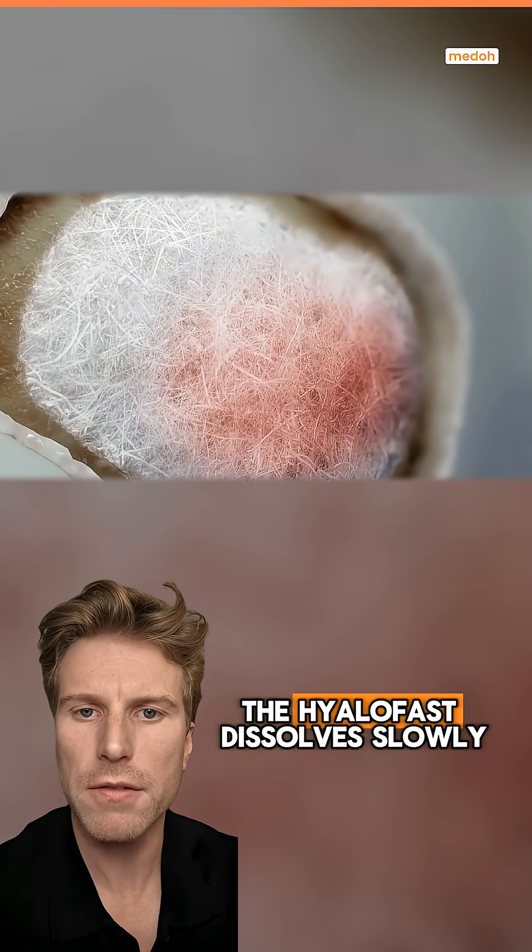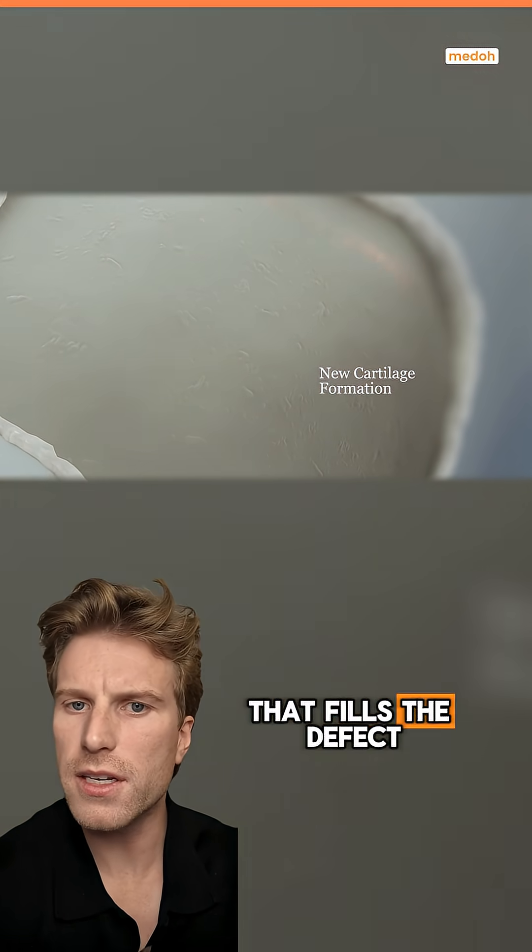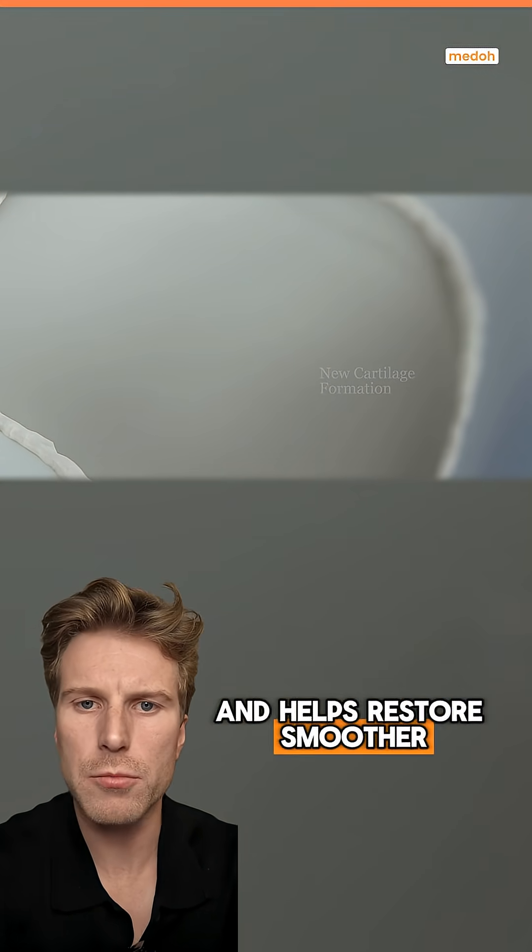As the healing progresses, the Hyalofast dissolves slowly, leaving behind newly formed cartilage that fills the defect and helps restore smoother movement in the knee.